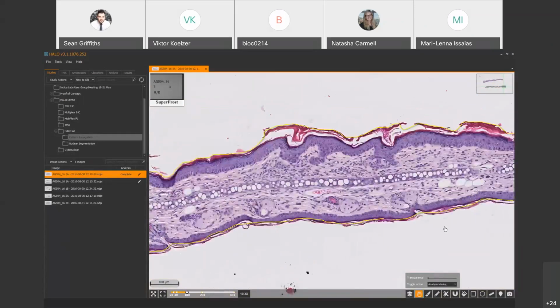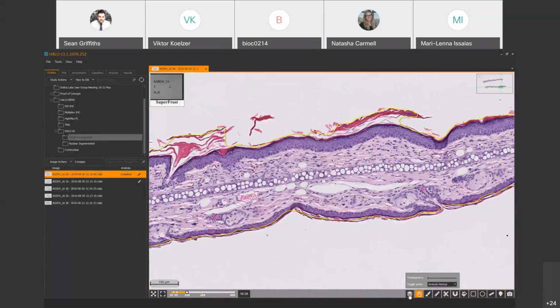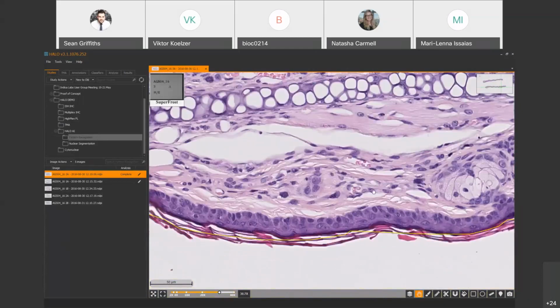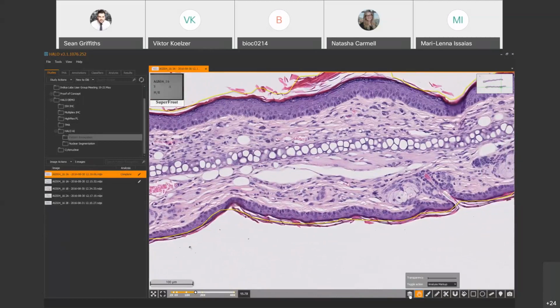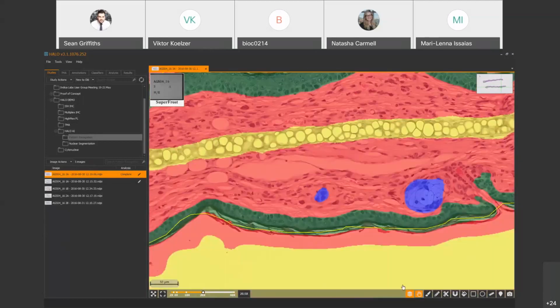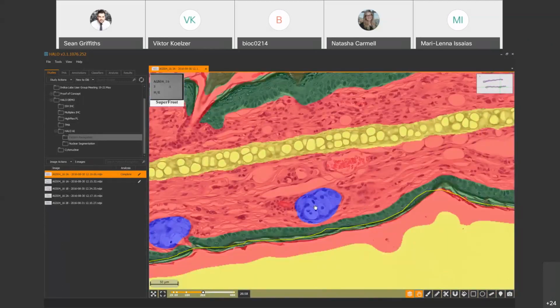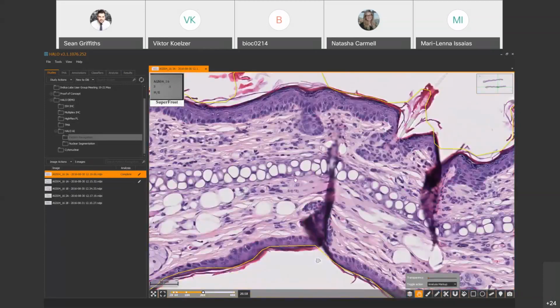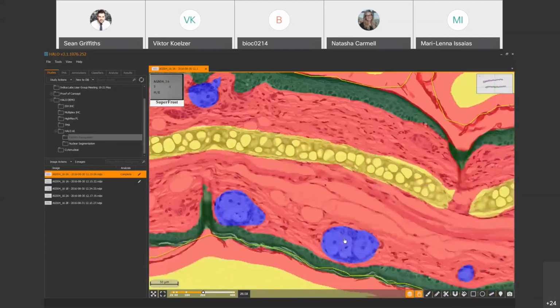Okay, so when you've done an AI-based analysis, I usually recommend having a little look through and seeing structures like this, where on first pass you won't think it's a gland. You'll think that the system's got it wrong usually, and then you'll look a bit more closely and realize that actually that might be something of interest, like here. That's not detected. That one is. That one is. That one is incorrect, so I'd probably suggest making a training mark over that region. Those two, that's correct. Correct.